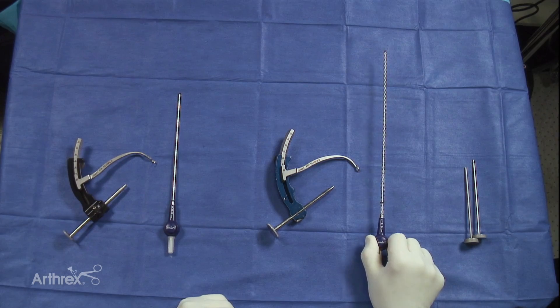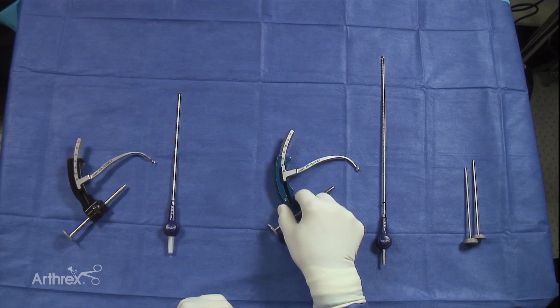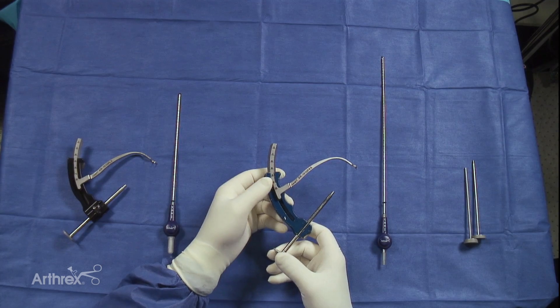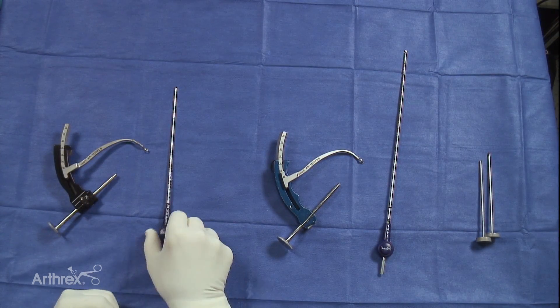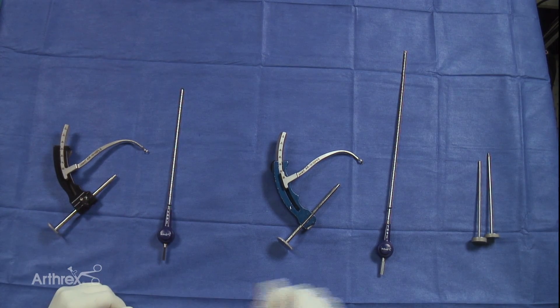For many years now, we've been using this longer version of the flip cutter, which you can see here on the right, as well as a guide that was a sort of standard guide for ACL reconstruction with some modifications for the pediatric group. Here on the left, you can see the modifications of both the guide and the flip cutter, which I'll point out.